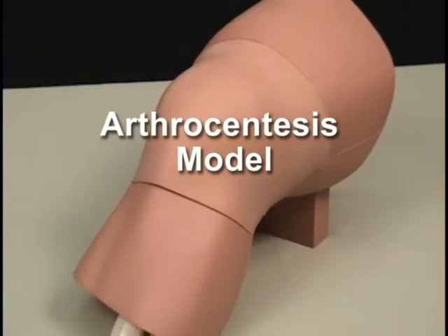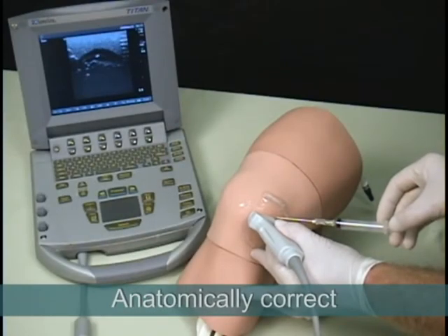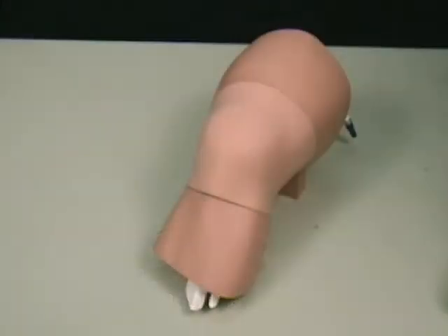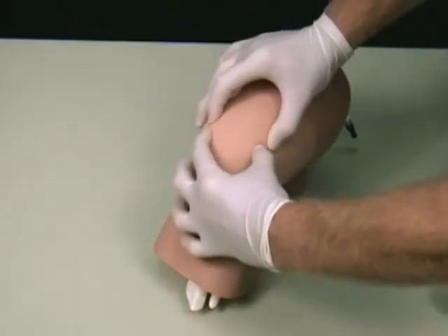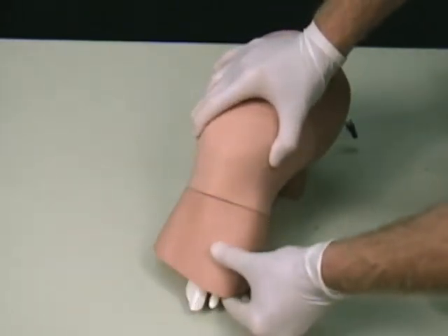Simulab's arthrocentesis model is a realistic soft tissue trainer that includes all anatomy significant to the procedure. The ultrasound-compatible model represents an extended left leg and includes the patella, patella ligament, tibia, fibula, femur, synovial sac, and synovial fluid.